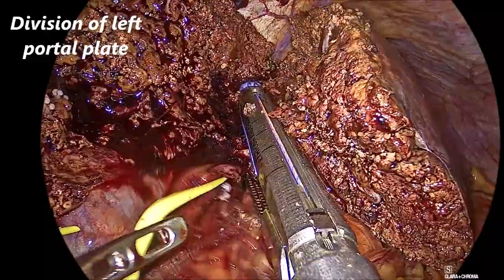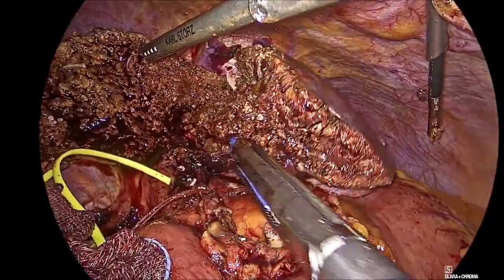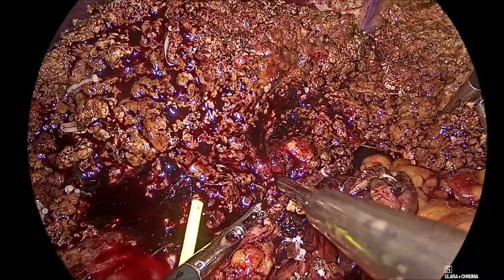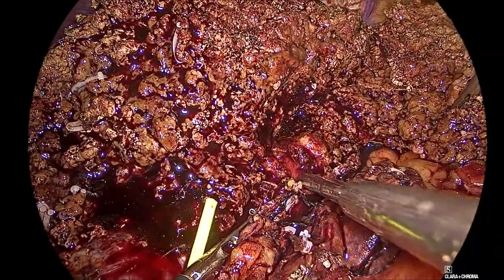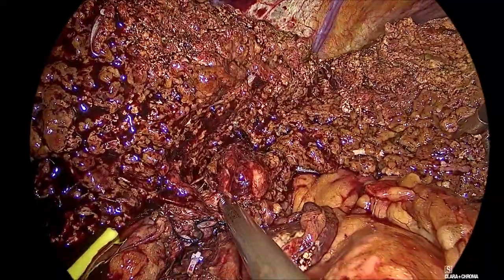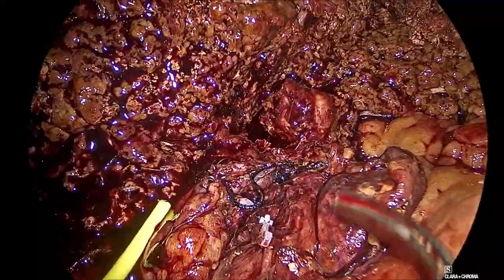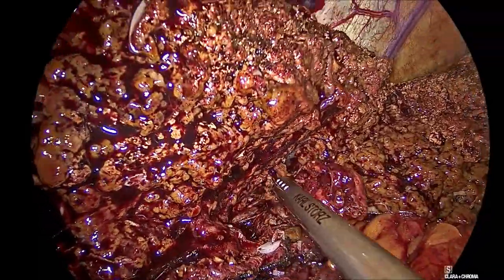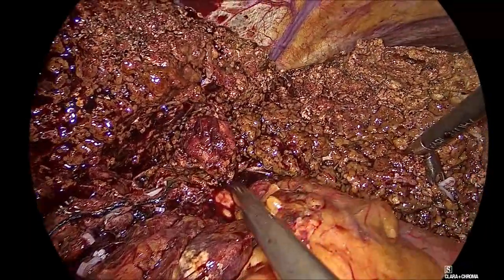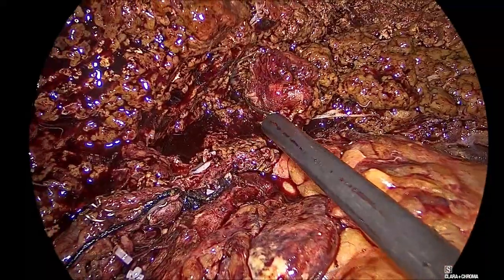Since the hilar plate contained portal vein, hepatic duct, and the plate itself, a blue stapler was used. Once fired, we could see the segment 4a metastasis — just cephalad and posterior, not only on the plane of the biliary confluence but posterior to it as well. CUSA was used since the lesion was very close to the middle hepatic vein. Several branches were directly draining from the metastasis into the middle hepatic vein; these were dissected with CUSA and taken down with clips.